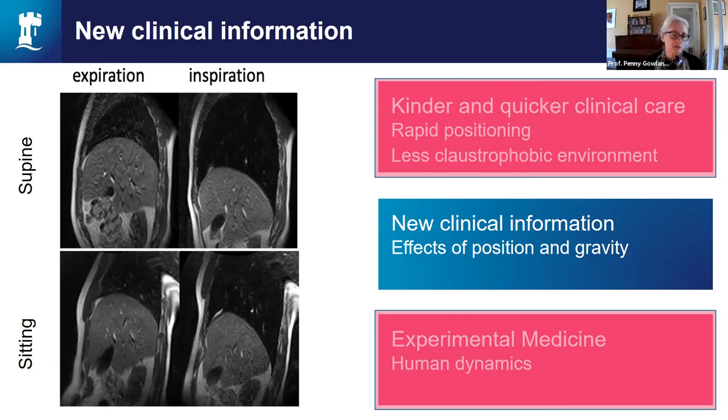And my clinical colleagues have told me recently that the need for non-invasive ways of looking at the lungs has increased recently, not so much because obviously we need to scan patients with COVID, but now there's the risk associated with doing lung function tests, which means they're more keen to be able to image the lung rather than do standard clinical measures.